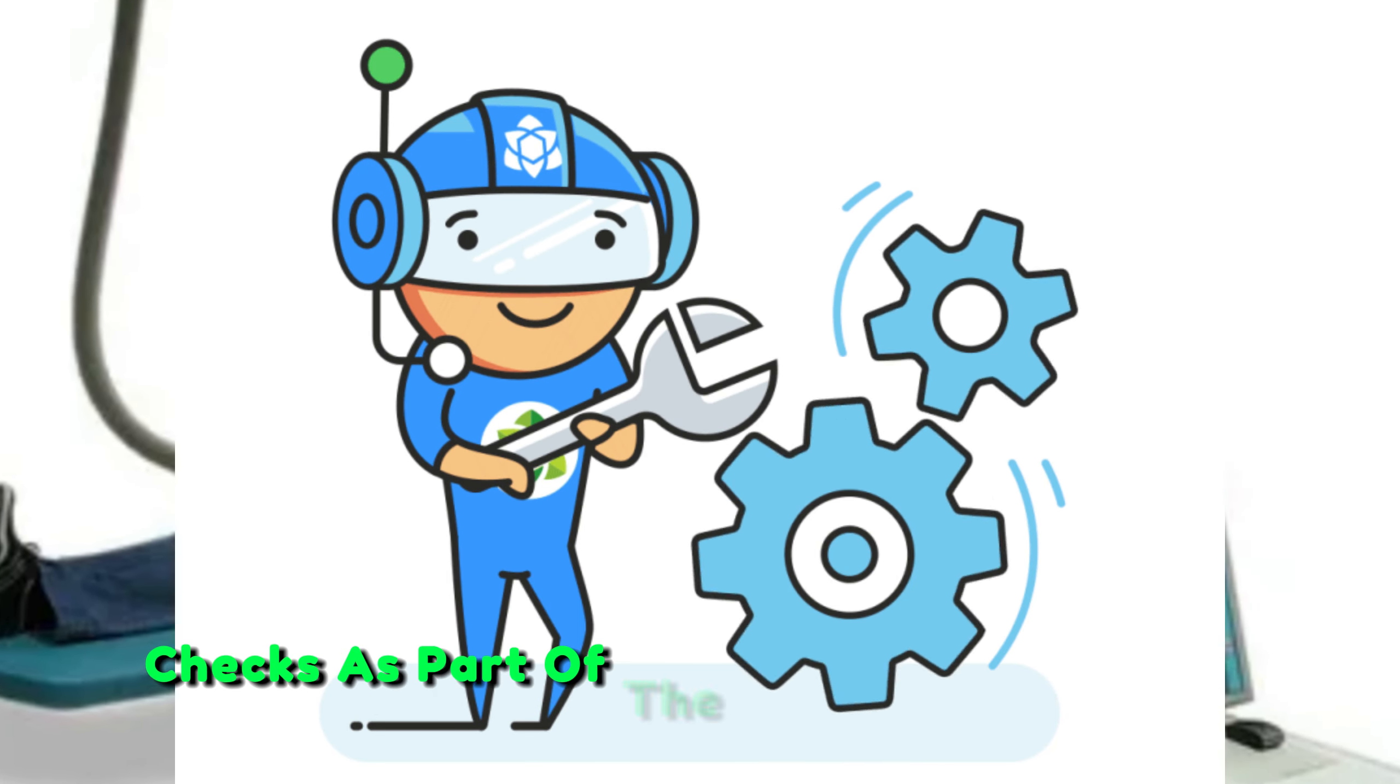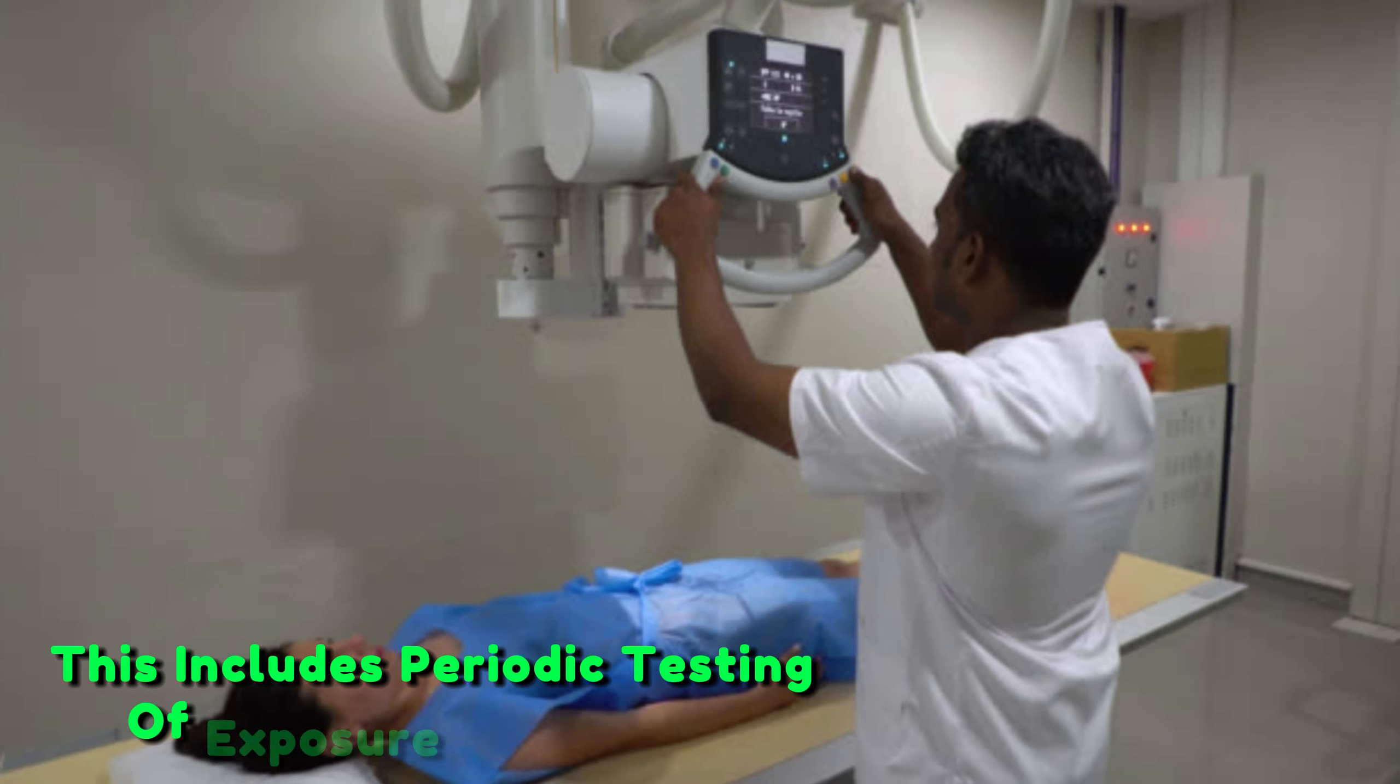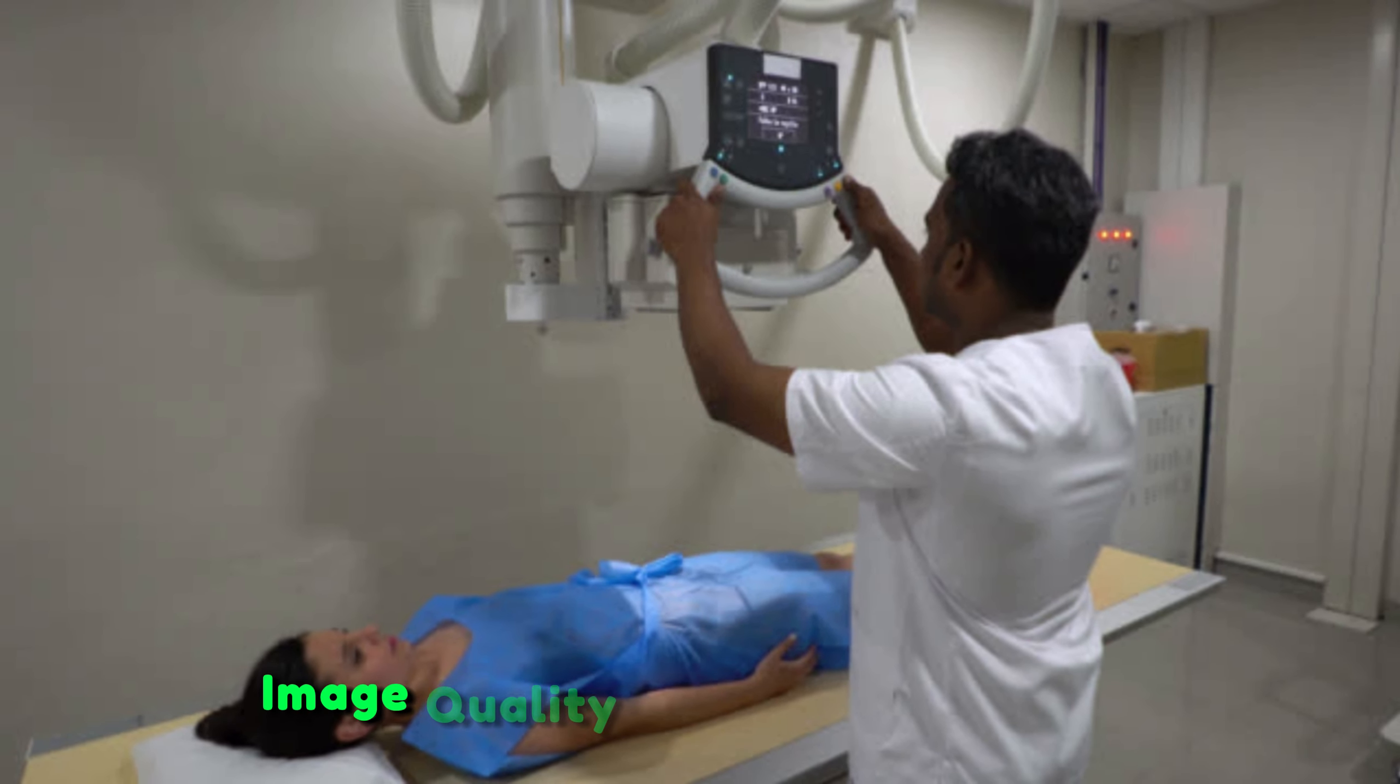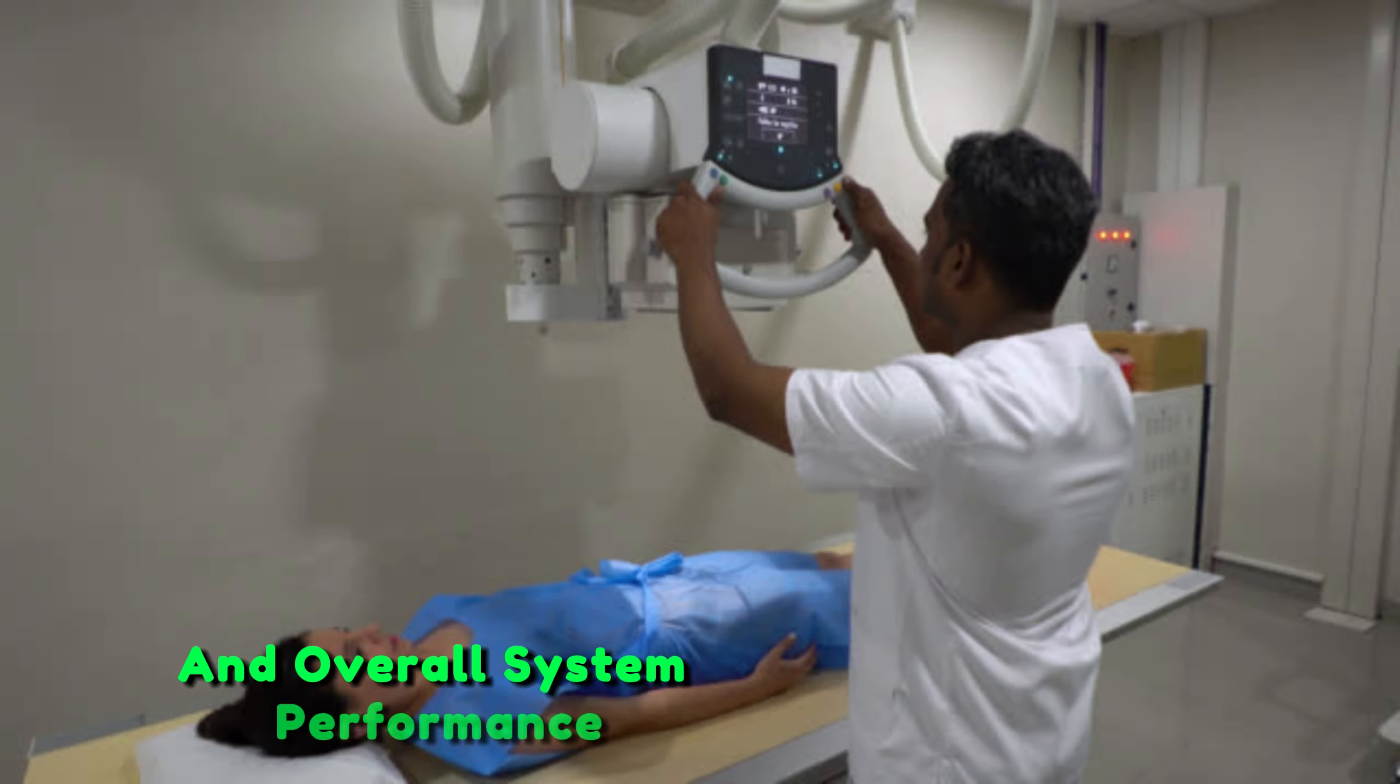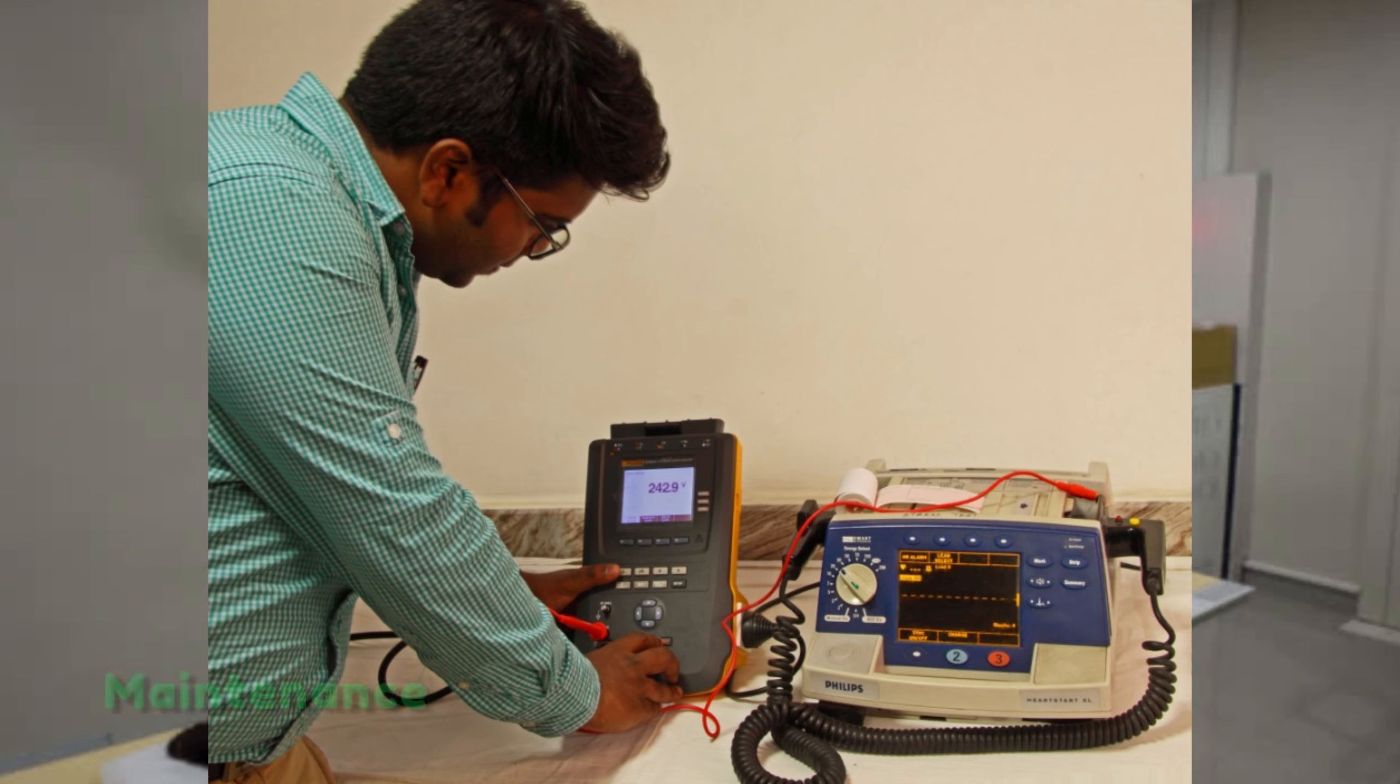Quality assurance checks. Implement routine quality assurance checks as part of the maintenance program. This includes periodic testing of exposure parameters, image quality, and overall system performance.